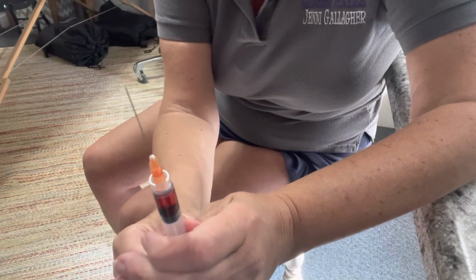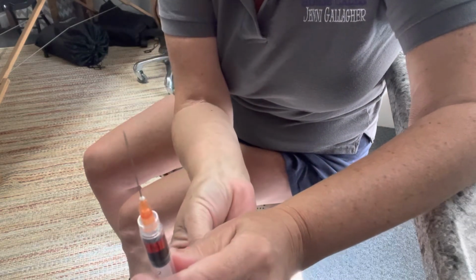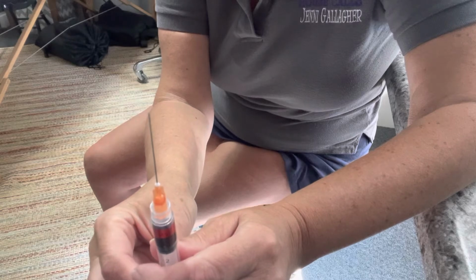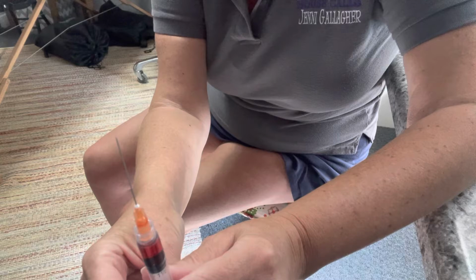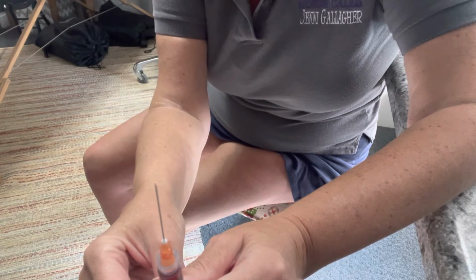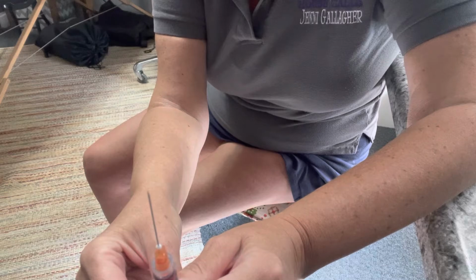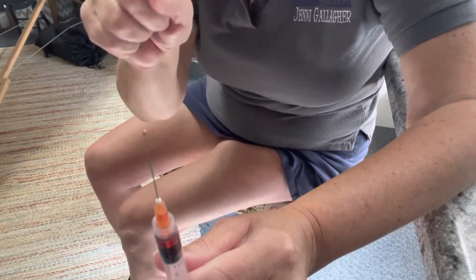So keeping our fingers away from the needle, I pull a little more air down to completely clear the needle and attachment, and then I push all of it very slowly until I see a tiny drop of medicine come out the tip. See, there's the medicine. So now there's no air.